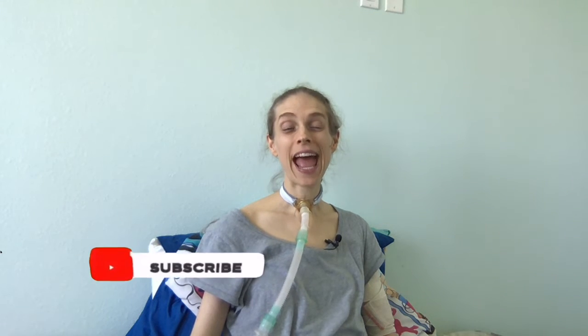When I first wake up in the morning, my tracheostomy site usually has a lot of discharge on it. I take some gauze and carefully clean around my tracheostomy tube site.